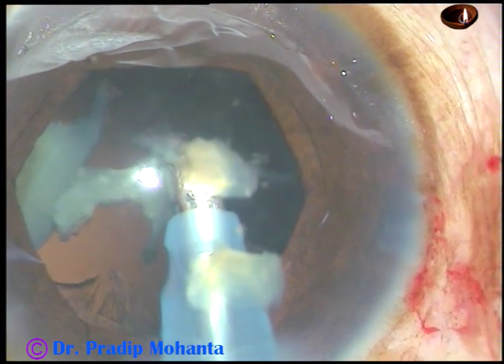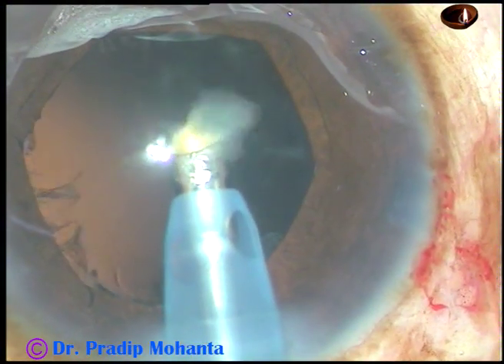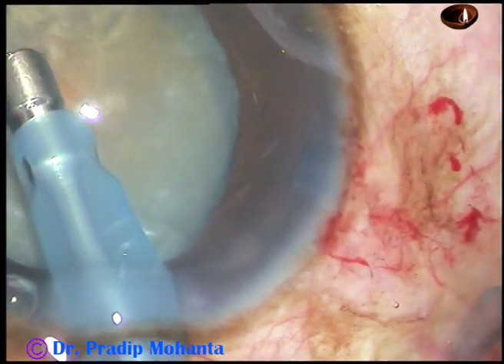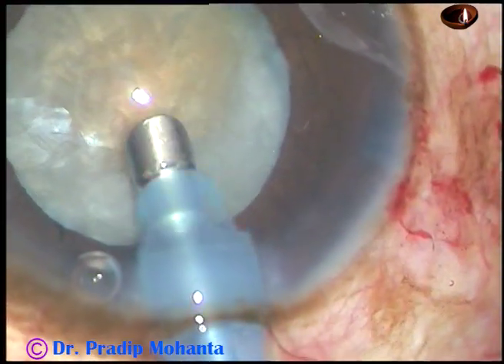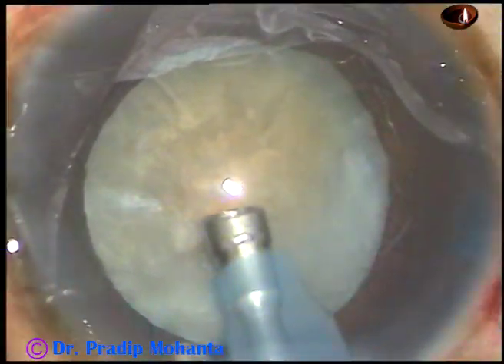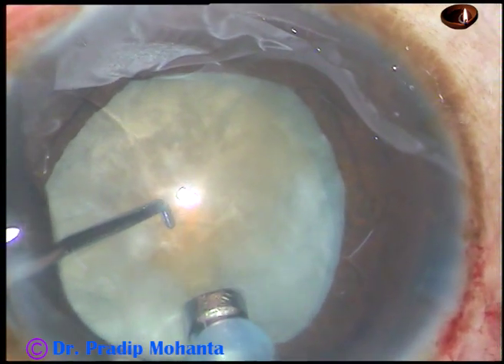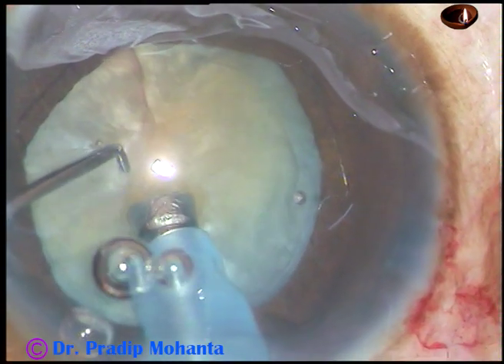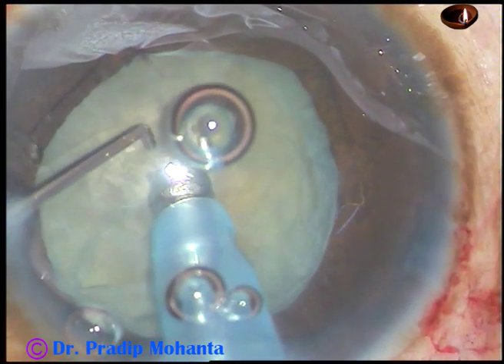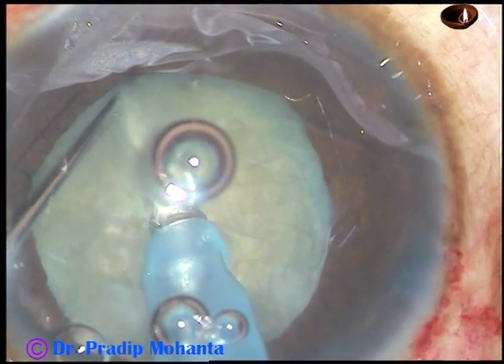This is in real time, and now we are going to see in slow motion. The tip is introduced with its bevel down. Some superficial cortical matter is aspirated, which improves visibility a lot. Then the handpiece is turned — the bevel is up. This is 50% speed. The chopper is introduced. The nucleus is pushed a little down. The tip is buried into the substance of the nucleus just in front of the main incision. It goes through the nucleus, through a track about 3 mm deep. After crossing the center, midway between center and the opposite equator, you chop.